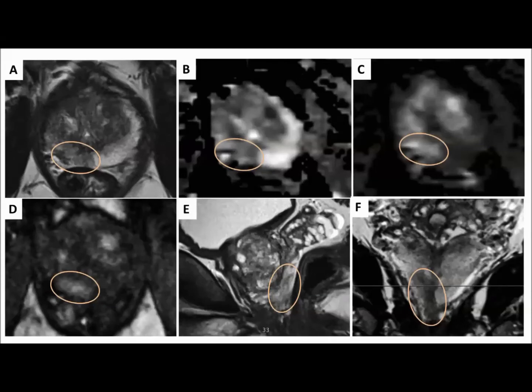So I think this is extremely important, because you really need to be good at differentiating between prostatitis and prostate cancer. In both conditions, the PSA would be raised. They can even have a suspicious digital rectal examination. And sometimes, if the MRI is not read properly, you can actually misdiagnose prostatitis as prostatic malignancy.